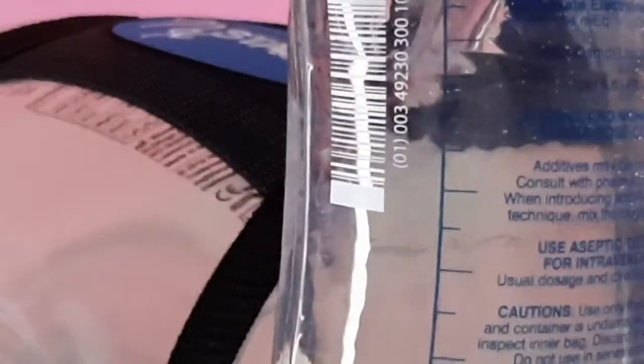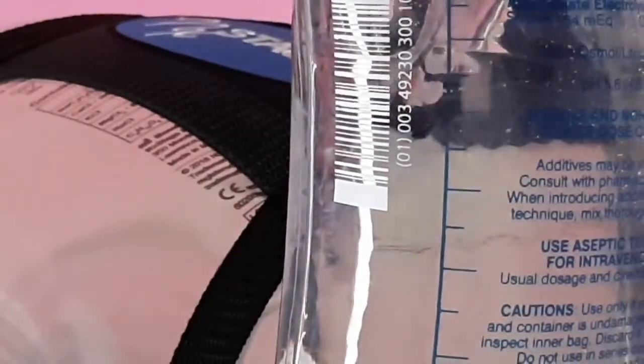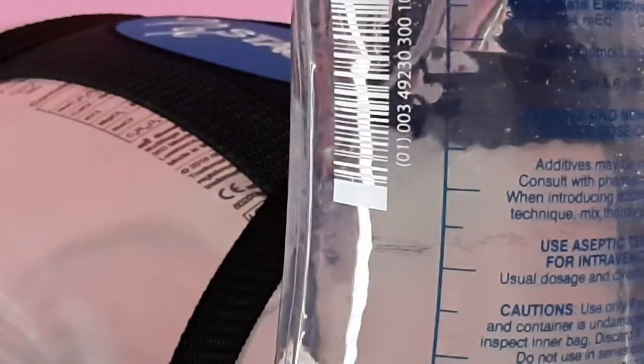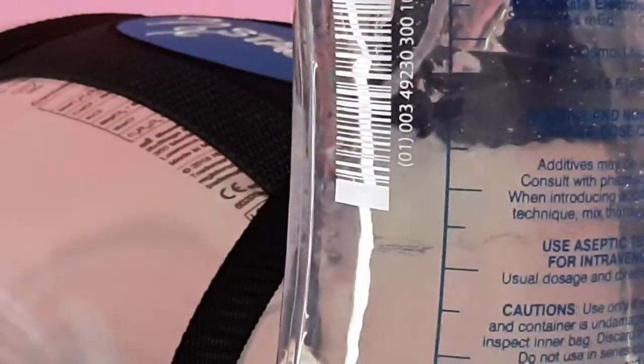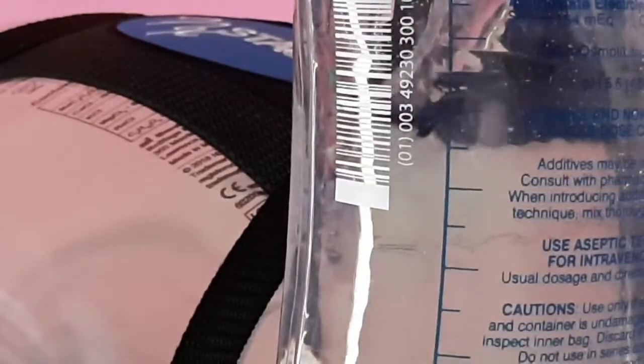But usually you'll see it, the bubbles coming up in the bags, as it pushes the air through the lines. See it? And up to the saline bag. And there it is, getting all the air out of the lines. It's important to do that, because you don't want an air embolism, an air bubble getting back into your blood, in your veins, an artery.